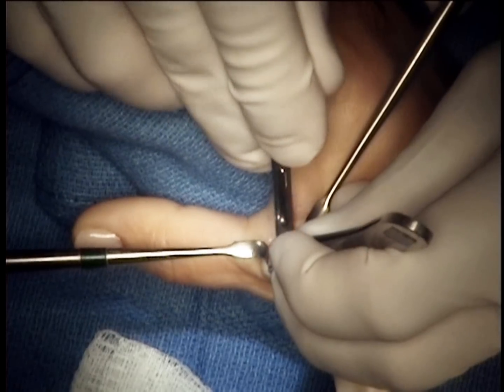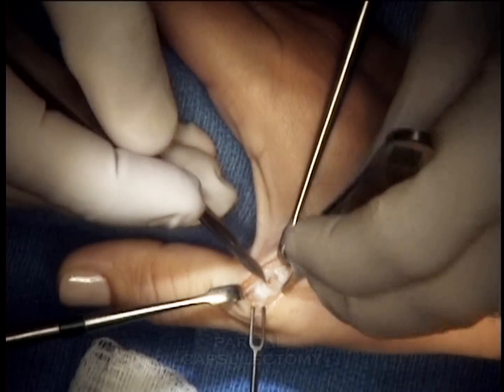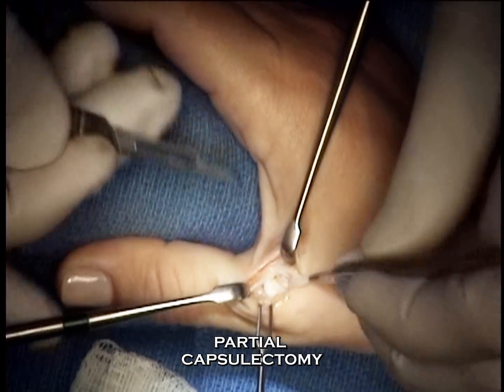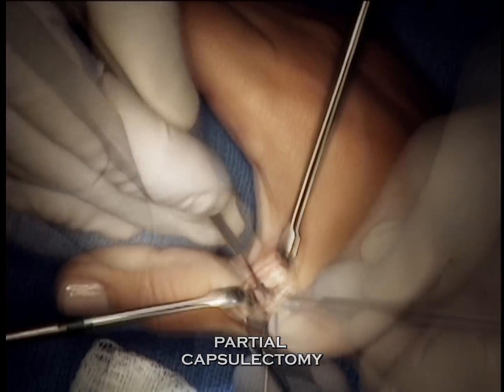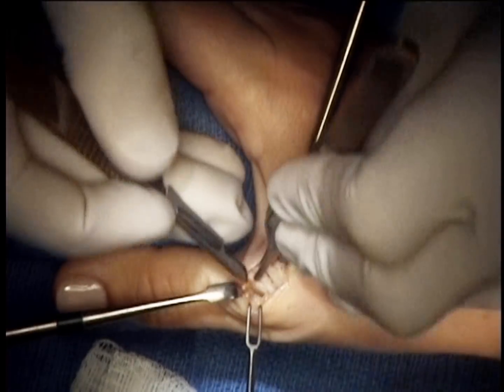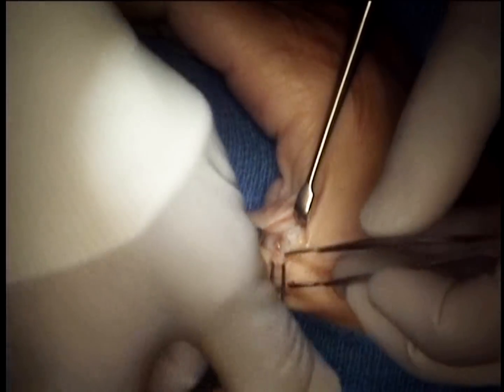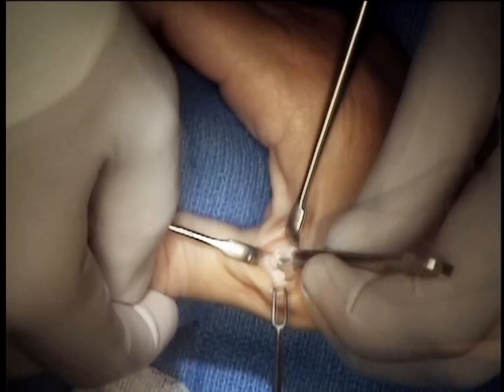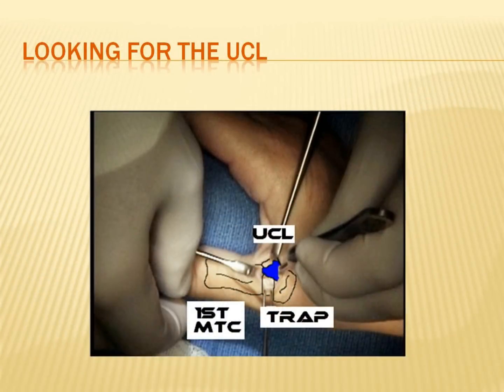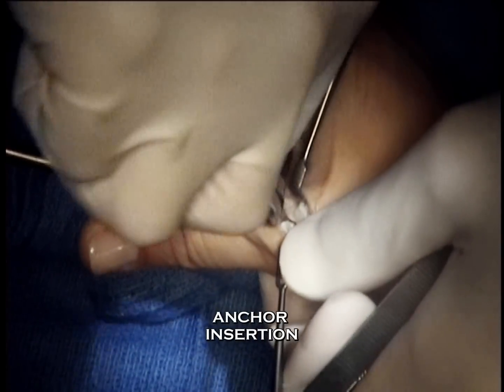At this point, we identified that the ligament is detached distally, as usually occurs on the ulnar side, and a limited capsulectomy will be done as well to free up scar tissue surrounding the ligament. The ligament itself is noted to be somewhat friable since this was not very acute, and one needs to protect the soft tissues in order to maintain some integrity of the collateral ligament remnant.